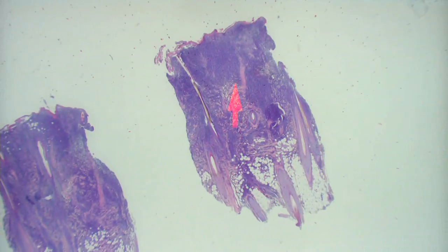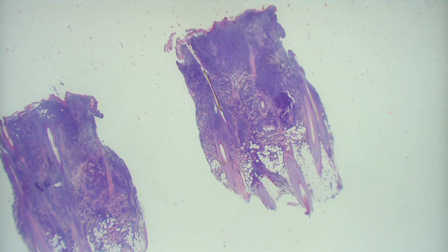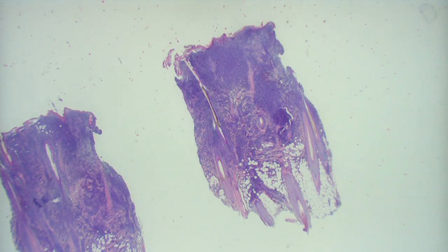All right. Who wants to give this one a go? Okay, we've got a punch from this view, a very dense infiltrate, superficial and deep. Yeah, it goes all the way to the fat. What kind of cells are these? They're very dark, so right now I'm favoring lymph.